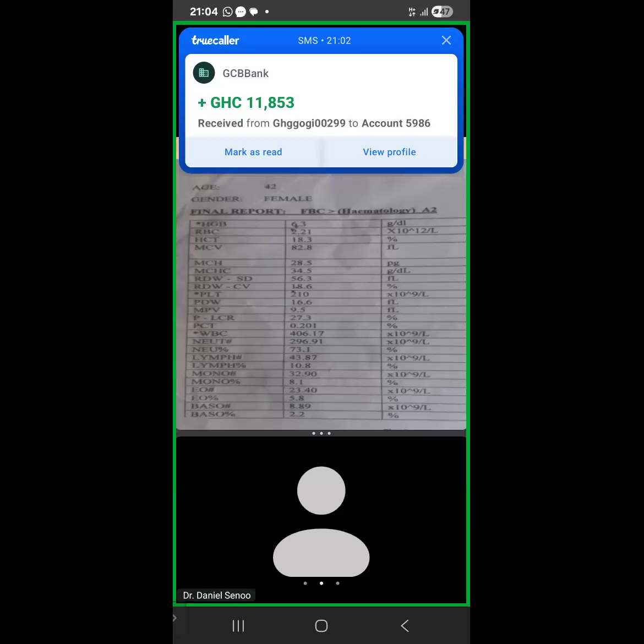If you have been listening, someone made a certain query. So what is it on the peripheral blood smear evaluation that would draw you closer to what you want to arrive at? What would you see the red cells to be? What would you see the white cells to be? What would you see the platelets to be? What would you expect that these things would look like on peripheral blood smear?